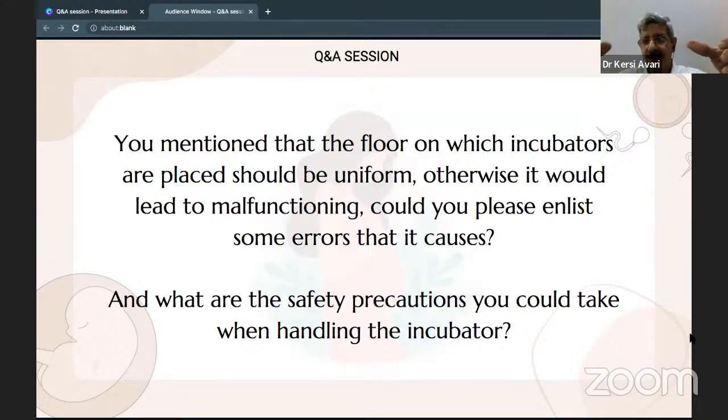You see the adjustable clamps, because you have to adjust with a spirit level, which will make sure the plane is perfect, and the incubator is neither this way nor that way. Because any change in the level, not only will the dishes be tilted, but the basic important thing is there should not be any temporary or minutest leakage of temperature or carbon dioxide, which can compromise the incubation or the equilibration.